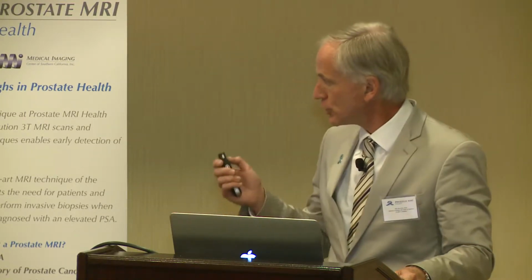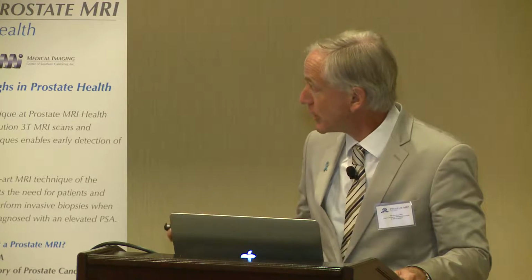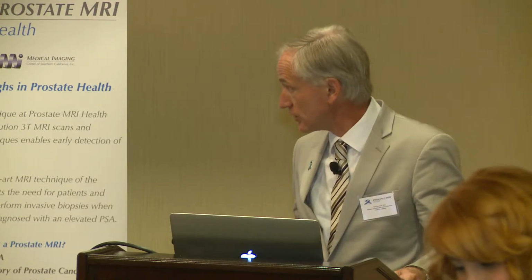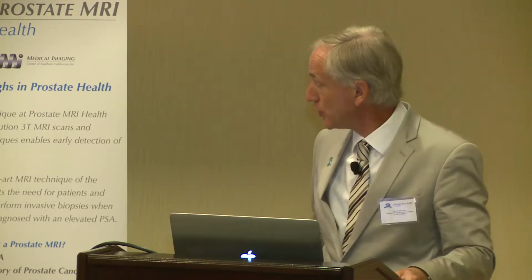You see the prostate, but discrimination of tumor with ultrasound is rather difficult. So there are some limitations, and I call it the 40-40-40% rule. First of all, a significant cancer which is anteriorly located most often is not seen by ultrasound and not biopsied, so it's missed. This is true in about 40% of cases. Second, if the diagnosis of cancer is there, how sure are you that you have biopsied the most rotten place of the apple? This is a Gleason 3+3, that means you don't have a very aggressive cancer. This is the Gleason 7, 3+4 or 4+3. This is the aggressive part. This tumor you should treat. This tumor, perhaps, can be followed by active surveillance. It's about 40%. Underestimation of tumor grade. I will come to that a little later.